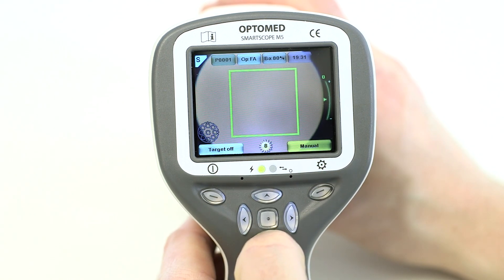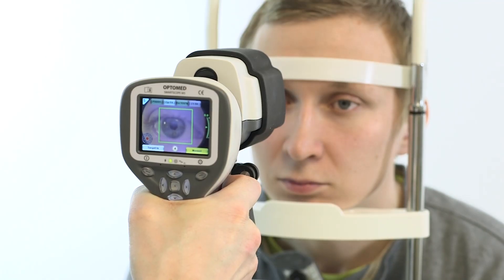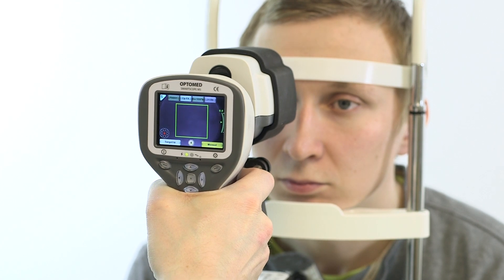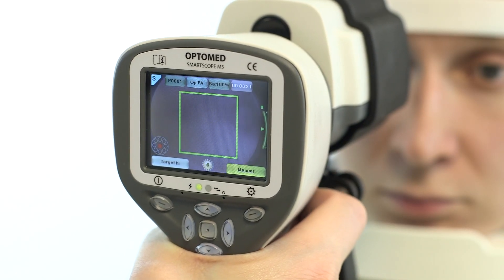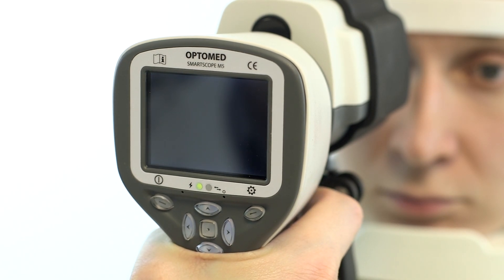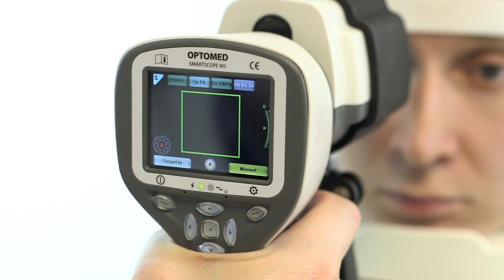you will need to adjust the diopter scale for the refractive error of the patient. By pressing the up and down arrow keys, you can change the focus point of the camera. After selecting the correct diopter, the image can be captured without additional focus adjustment. Simply approach the eye until the aim help square turns green, then capture the image by pressing the shutter button to the second position.